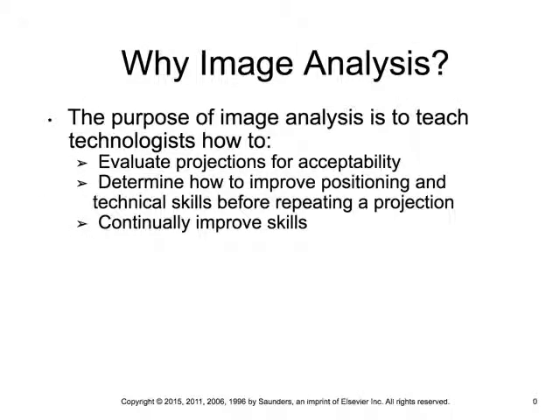So why are we doing this? We want to teach you how to teach yourself, right? If you have learned image analysis appropriately, you will continue to improve as a technologist throughout your career. You'll get better pictures, you'll have lower dose, and you'll be able to contribute to the development of protocols and things like that. Additionally, you're going to start to learn a little bit about pathology. As we do image analysis, we can start to learn about what looks out of sorts. Like, is that positioning or is that actually a pathological condition?